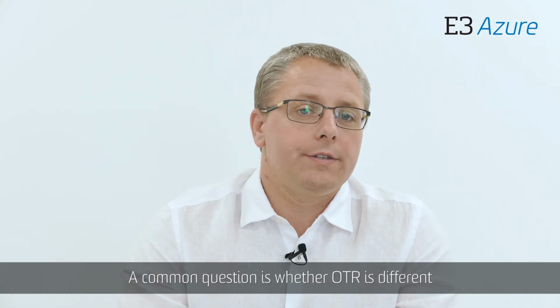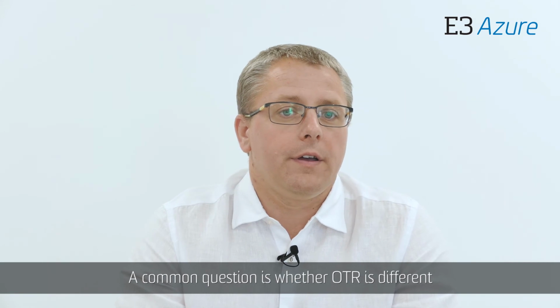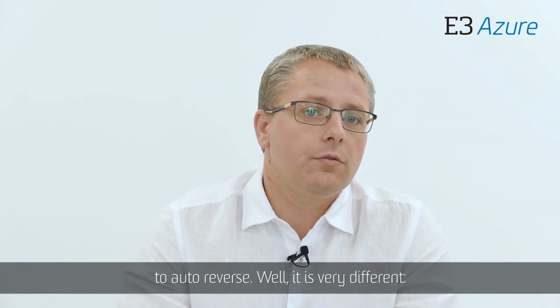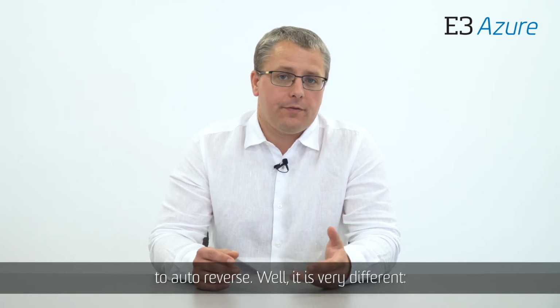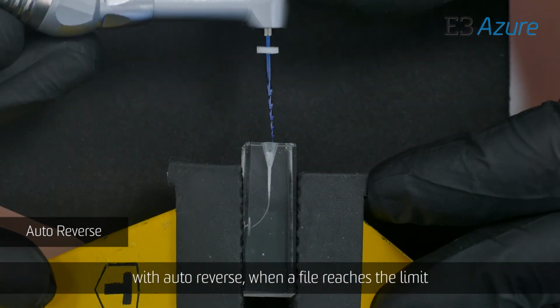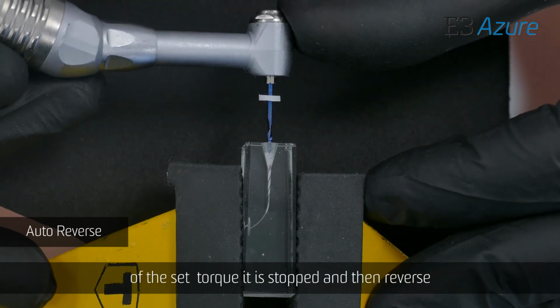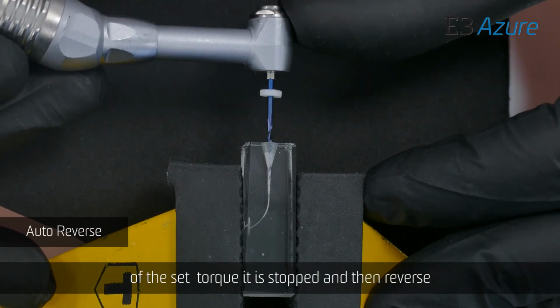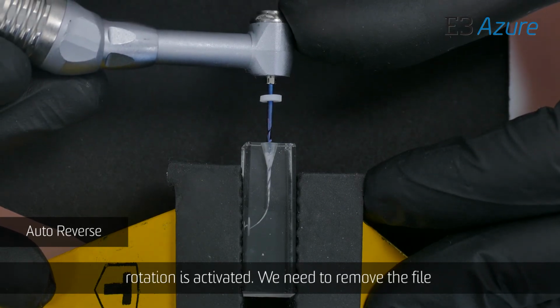A common question is whether OTR is different to auto reverse. Well, it is very different. With auto reverse, when a file reaches the limit of the set torque, it is stopped, and then reverse rotation is activated.